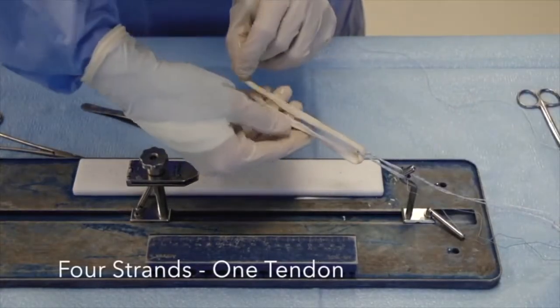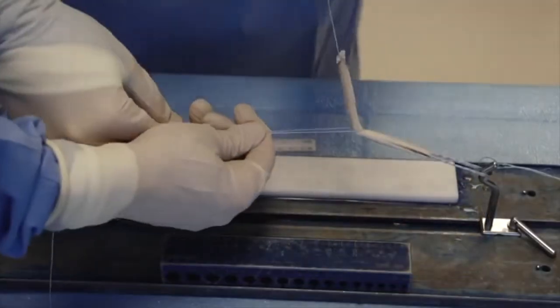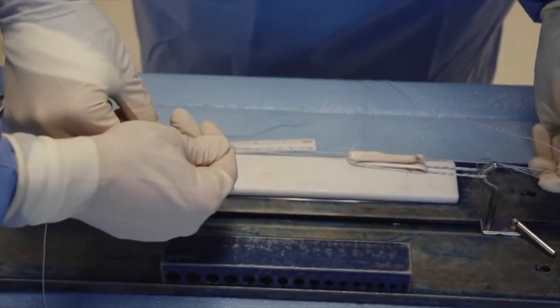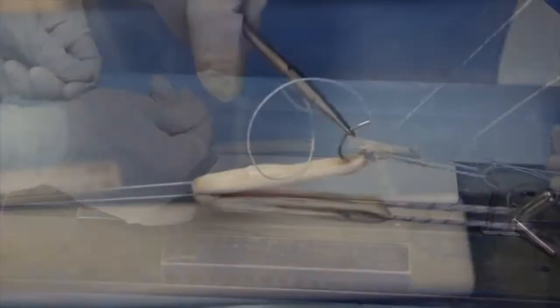We will demonstrate the four strand technique with one tendon. Once the two free ends of the graft are stitched together, a suture is passed in the middle and the tendons are folded.